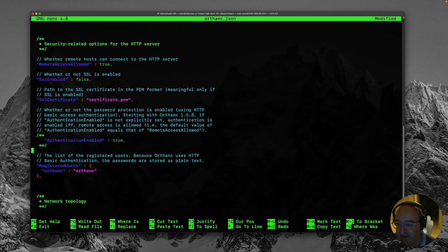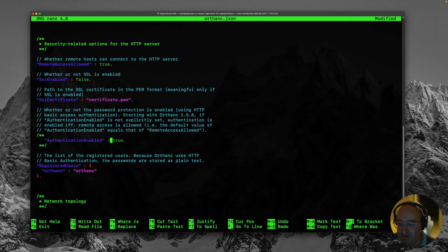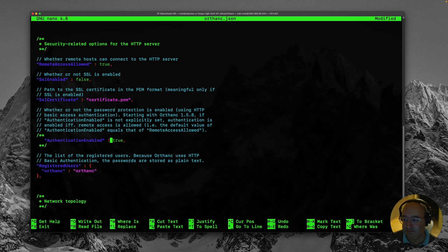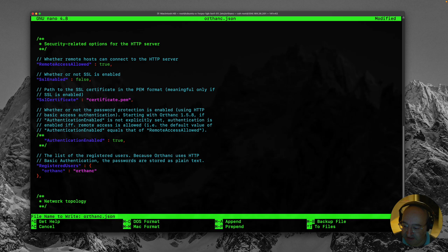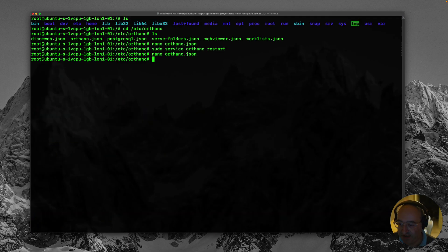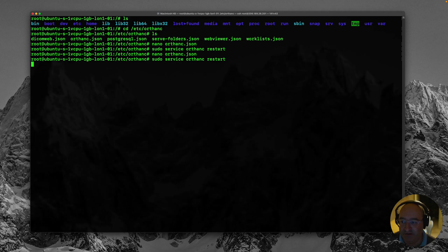And authentication enabled. True. Okay. Let's try that. Control X. Yes. Save and exit. And remember we do need to do another server restart. Let's give it a go.